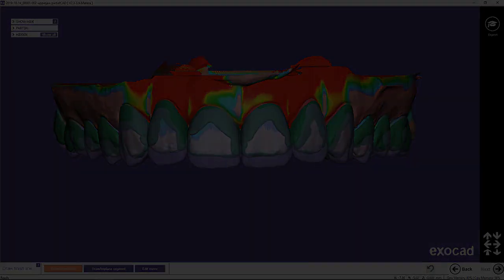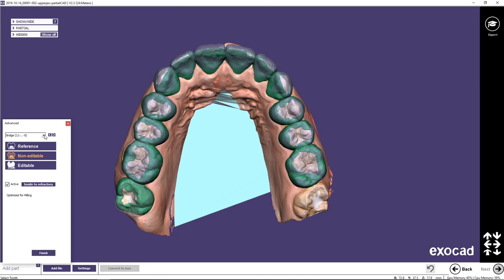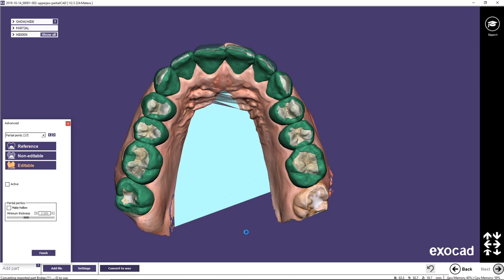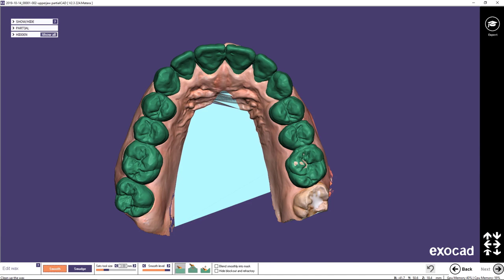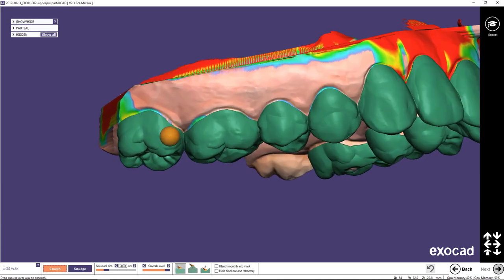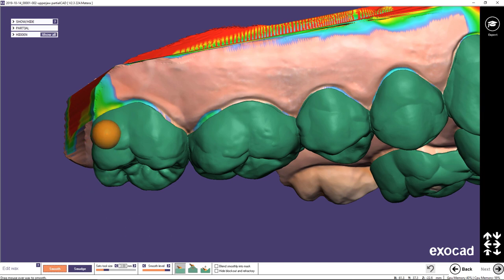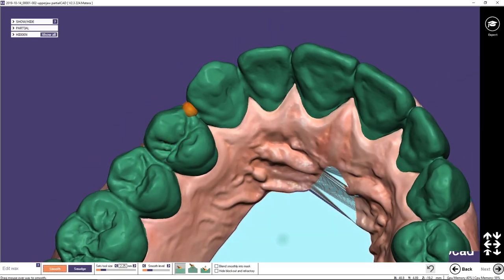Once you've added material everywhere you want, you can click next until you reach the step add part. Here you can finally add your anatomic setup. For this I'm selecting the objects and switching them to editable — since we have one partial pontic and one bridge you only have to switch up two of the objects. Just click convert to wax and you're done. If you had selected partial pontics for all teeth in the dental DB this would also work, but you would have to switch all of them separately to an editable object. In the edit wax step you can smooth out all of the edges in the transitions between the minimum thickness and the anatomical shapes, while it still pays attention to the anatomic shapes for the interiors so as not to destroy the shape set up in dental CAD. I also like to smooth the area in the approximate contact points a little bit, which helps for production when printing — if you're milling it this won't make a difference.